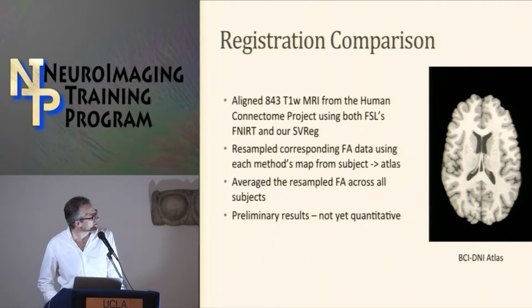And then finally, in the registration, I'm going to show you some results. These slides aren't in your talk. These are preliminary results, and they're not yet quantitative, so I didn't want to put them out, and you should take them with some caution since we haven't completed the study on this. This is just an initial comparison we did to see how well we were doing at registering the data.